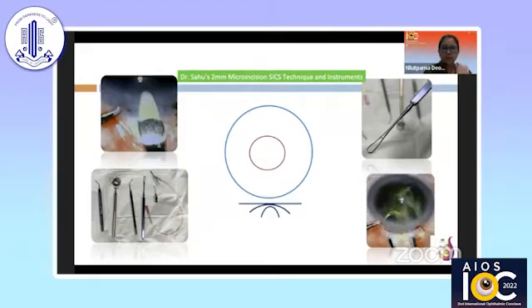I would like to bring to your observation one instrument — the sturdy vectis. It is a solid, sturdy but sleek vectis which helps to manipulate the nucleus as well as support it during bisection with the visco cannula. We are also using certain other instruments: the marker, the modified Sinski hook, and the multi-jet and single-jet cannulas for washing the endothelium of remnants of cortical material.